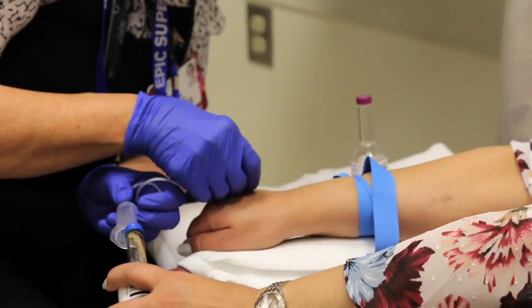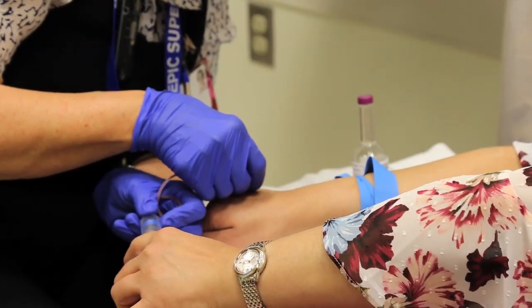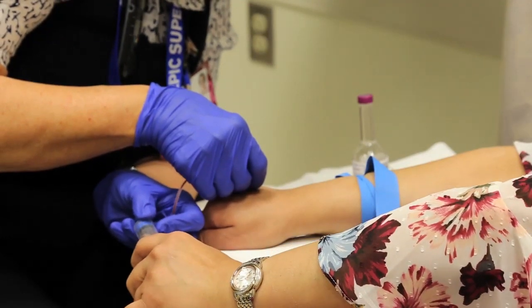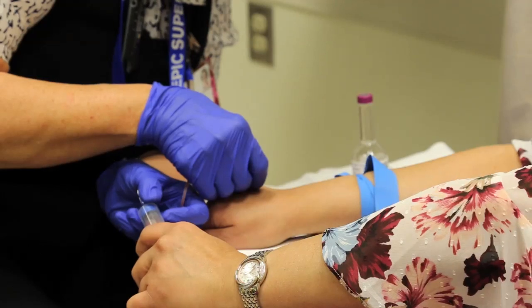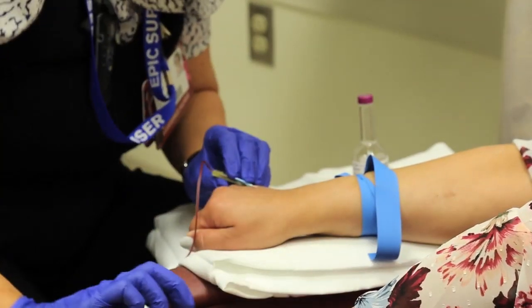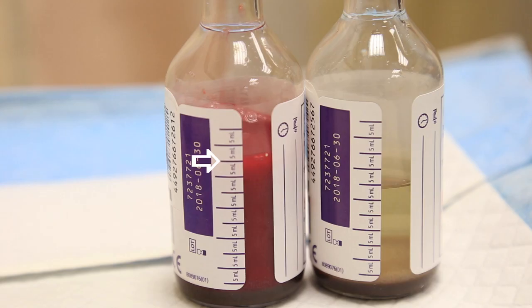It is important to obtain a sufficient amount of blood in the blood culture bottle. In reality, less than 50% of submitted blood culture bottles are actually ideal with respect to quantity. For every 1 ml missing, there is a 3% decrease in sensitivity. For bottles only half full, the sensitivity decreases to 70%. So basically, patients could have bacteremia that we do not detect because we did not optimize our blood cultures. The right amount should be 8 to 10 cc's full.